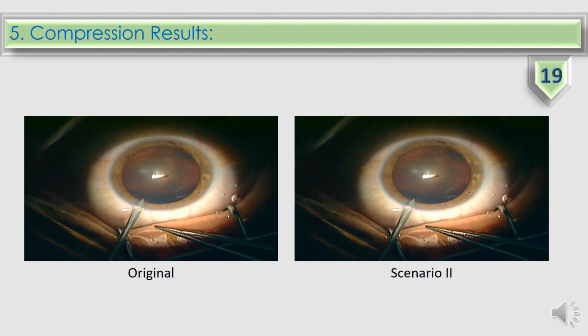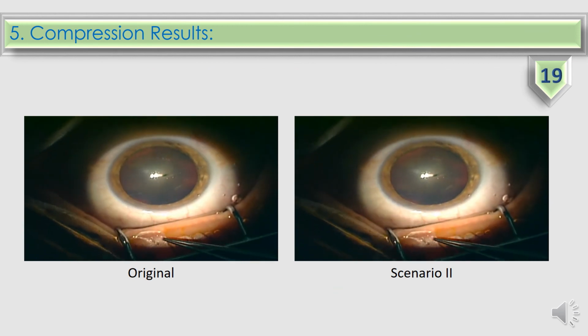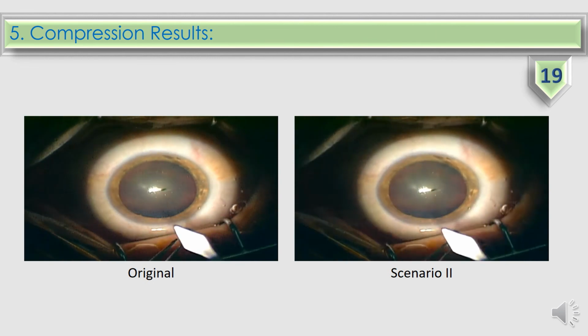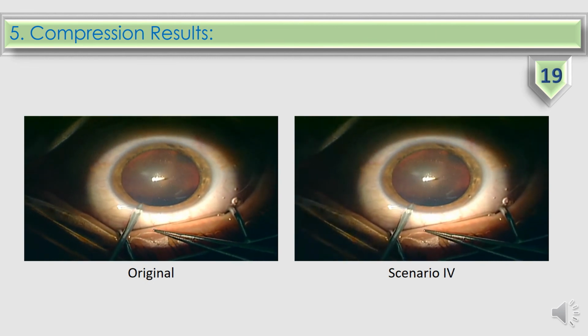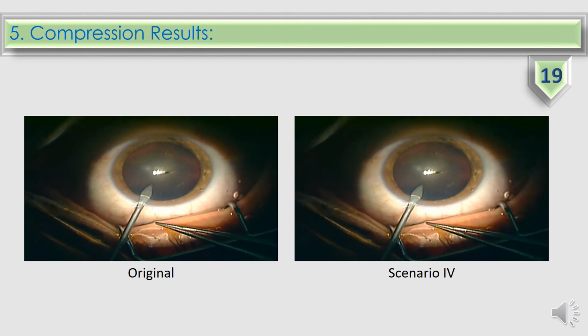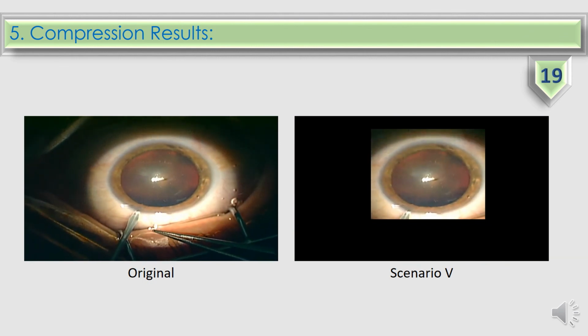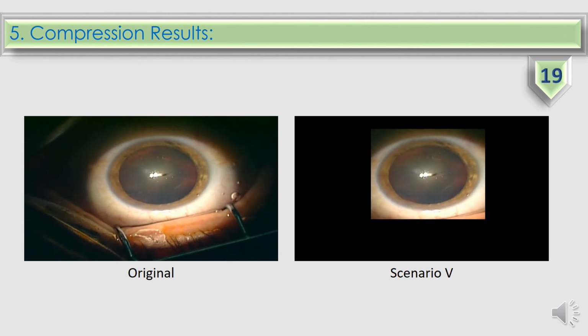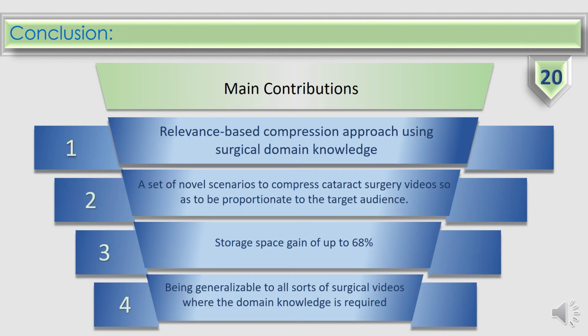Here, you can compare the quality of the original video with the video compressed based on scenario 2, scenario 4, and scenario 5. And it shouldn't be left unmentioned that this framework can be generalized to all sorts of surgical videos where domain knowledge is required.